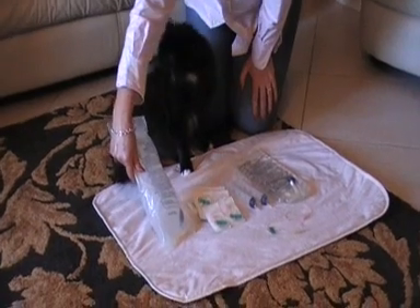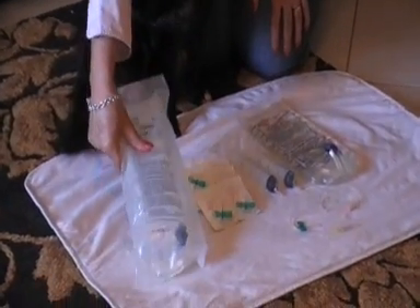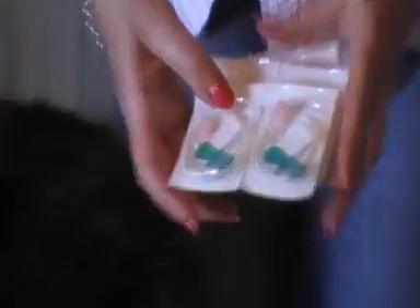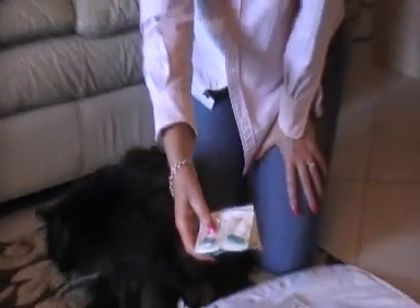A Hartmann solution — in America it's Ringer's Lactate — and it comes in a bag like that. Then you need the small 21 gauge needles, butterfly needles preferably, and this is a good size for all species, not too small and not too large.